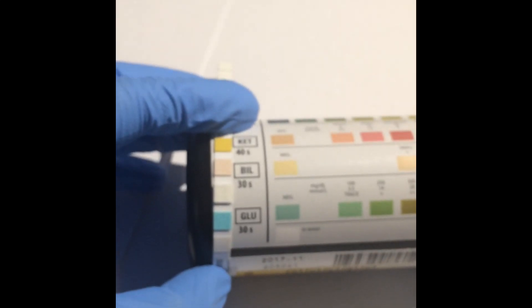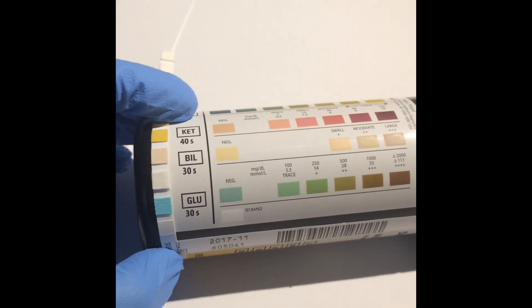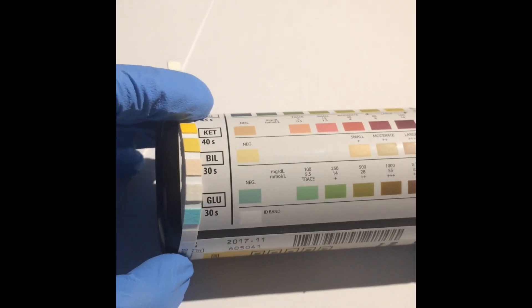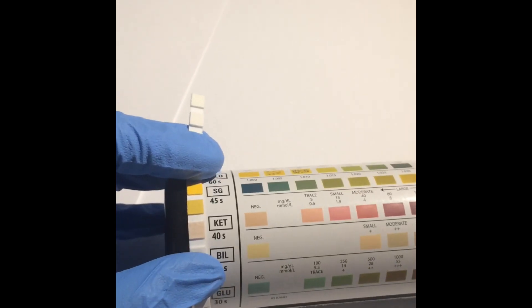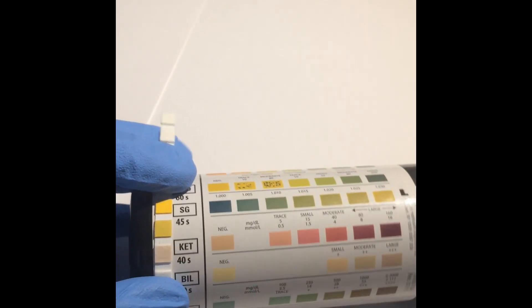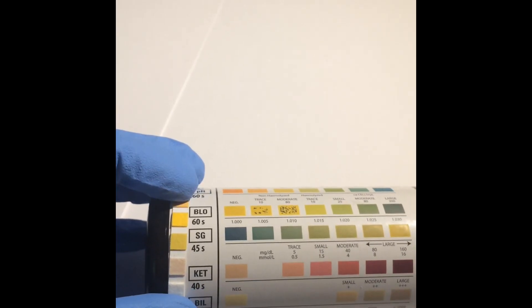First up is glucose and bilirubin, which will be read at 30 seconds. Comparing the color of the dipstick square to that on the bottle will indicate if it's negative, trace, or if the level is positive for each parameter.